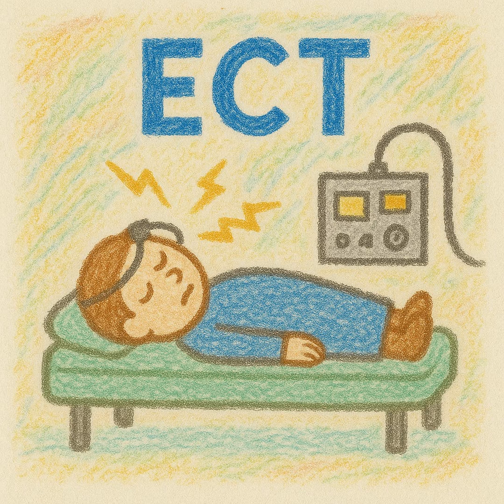And anything below 0.5 milliseconds is considered ultra brief pulse width, and 0.5 and above that we typically use is brief pulse width. Ultra brief pulse width, so less than 0.5 milliseconds, tends to be associated with more efficient seizure induction and fewer cognitive side effects, but possibly could be less effective.